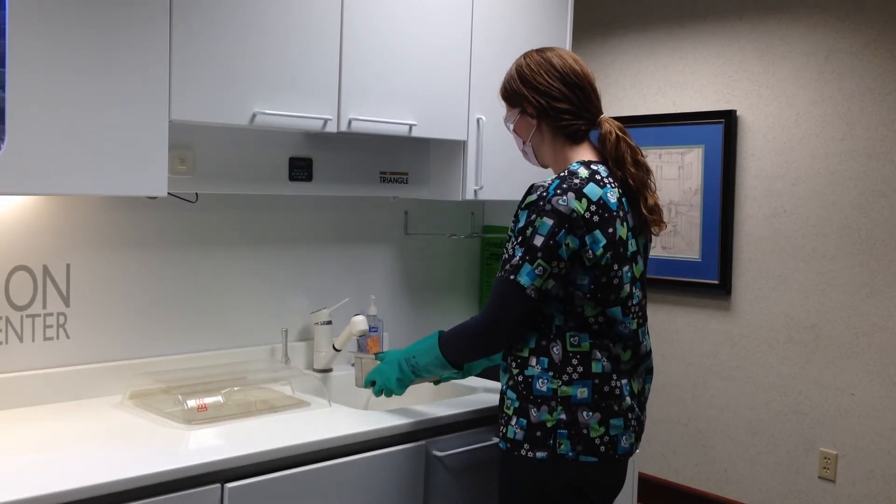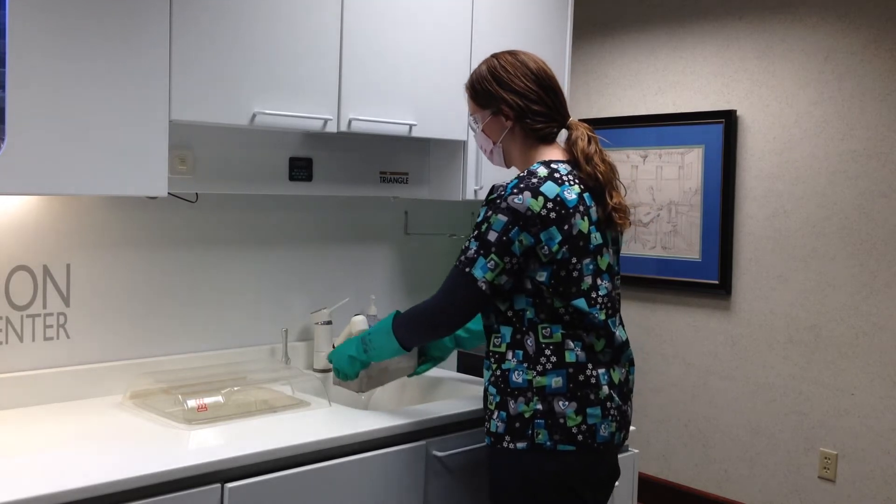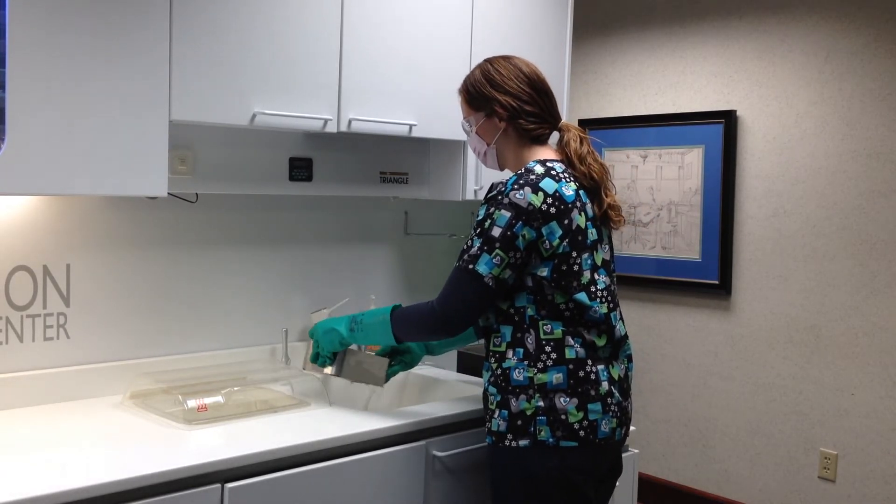When the cycle is complete, the inner basket is lifted and removed and taken to the sink for rinsing.